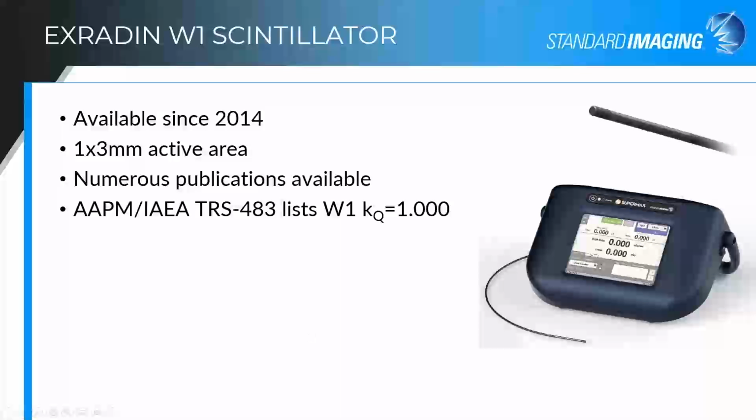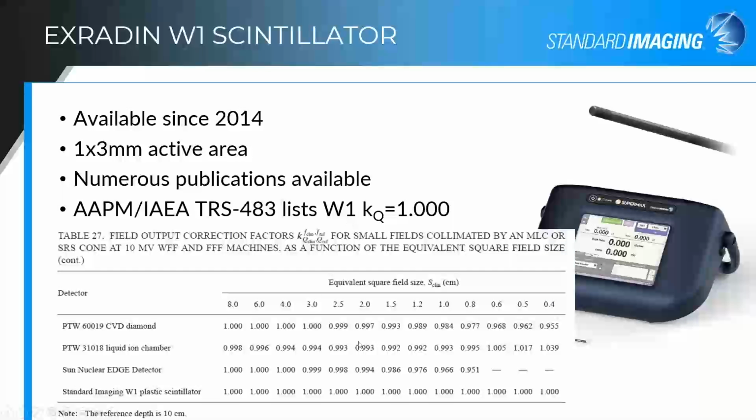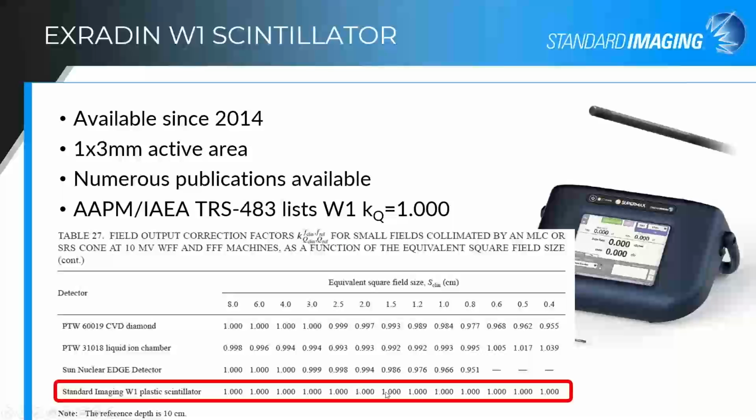So with the W1, that original version, that's been out since 2014. It's kind of hard to believe it's been 8 years, but it's been out that long. It has a 1 by 3 millimeter active scintillator at the end of that fiber. And there are quite a few publications available about the W1, but the most notable is that joint publication from the AAPM and the IAEA on small field dosimetry, that's TRS 483, which lists the W1 with that KQ of 1 in every single table that it shows up in.